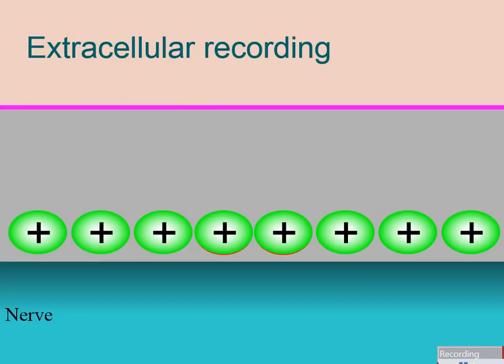Now, when we're recording for electrodiagnostic purposes, we're not doing intracellular recordings. We don't have very fine needles. We're not placing them very precisely within the cytoplasm of whatever it is we're recording from. We're out there in the tissue somewhere at some distance, actually. Sometimes not very close, sometimes very close, but never inside the axon or the cell body. So what we're recording is the fluxes in the ions within the extracellular space, those ions that are surrounding the excitable membrane that we're interested in.